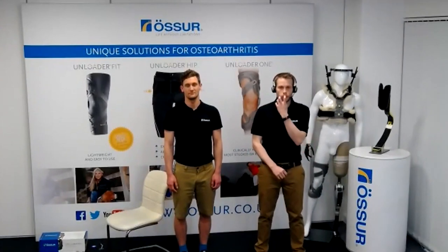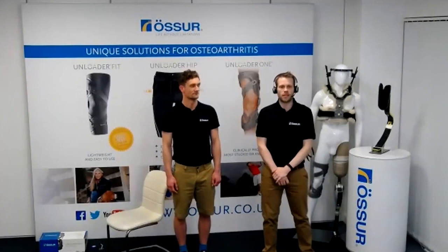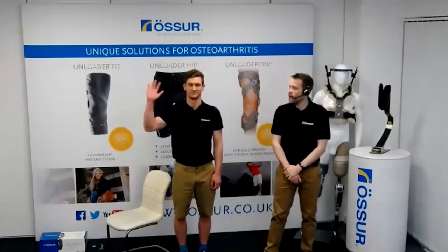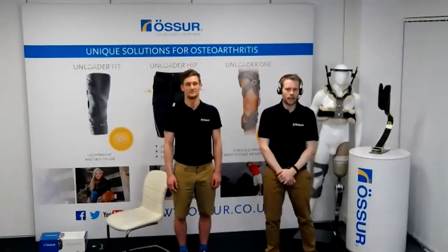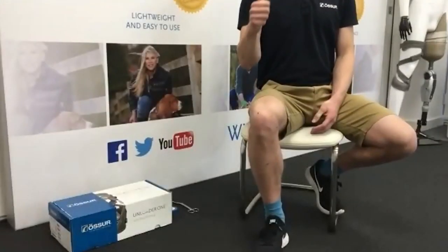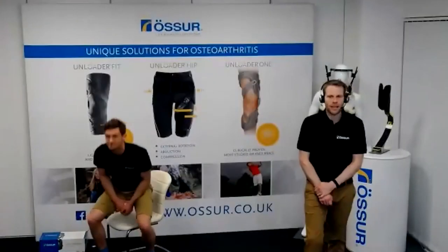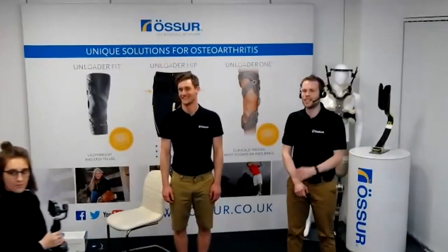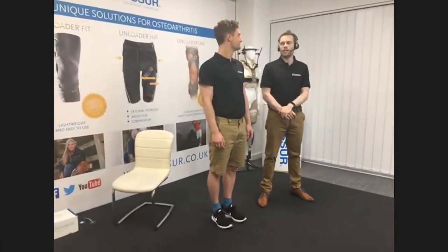I'm going to talk you through the webinar setup and the team helping us today. My name is Giles Leeming, a clinical specialist orthotist based in Stockport, where we're transmitting from. My colleague Peter Gill is the area sales manager for Yorkshire and he's going to be the leg we fit all the braces on. We also have Izzy with a mobile camera, who can highlight specific areas and follow Pete as he walks around wearing the brace.